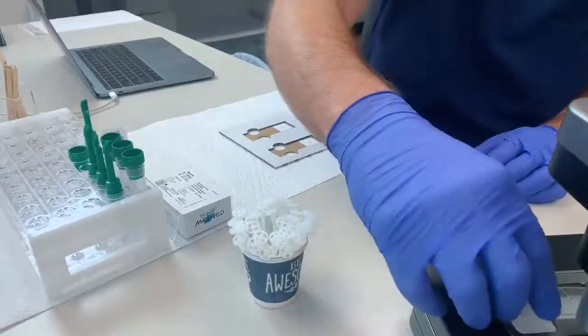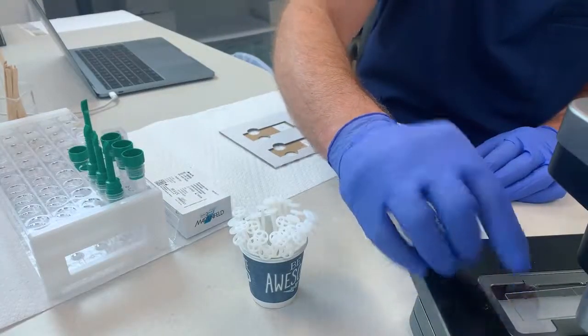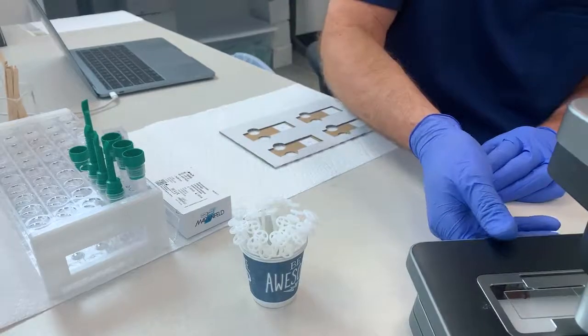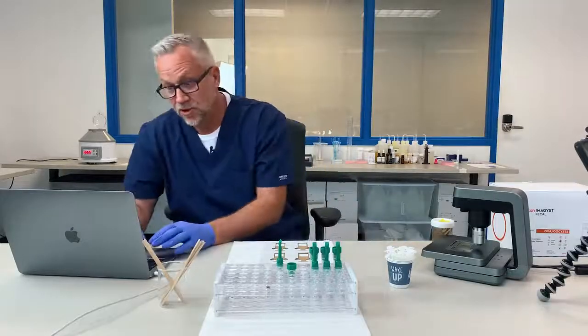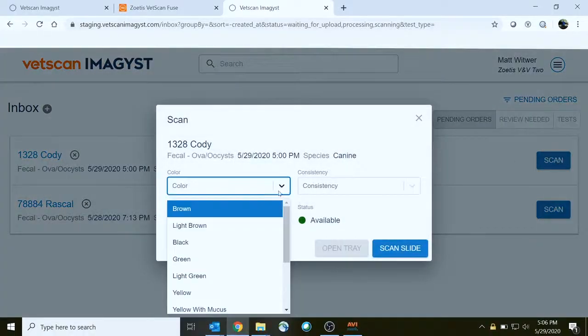We're going to place that in the scanner, and we're going to move over to Imagist and scan that slide.